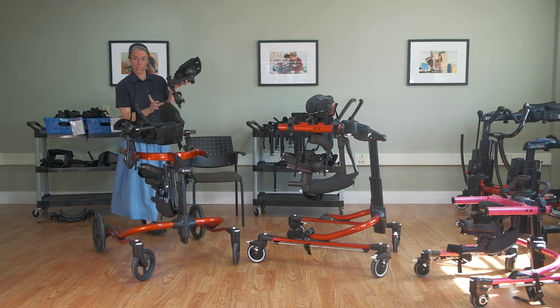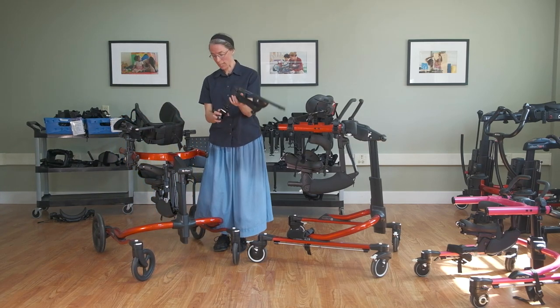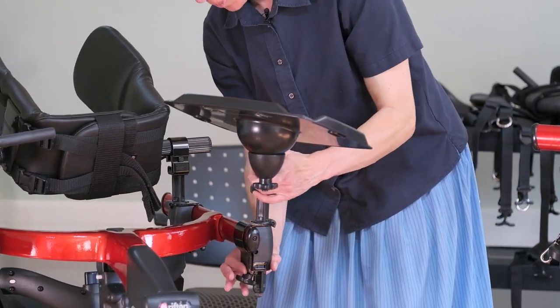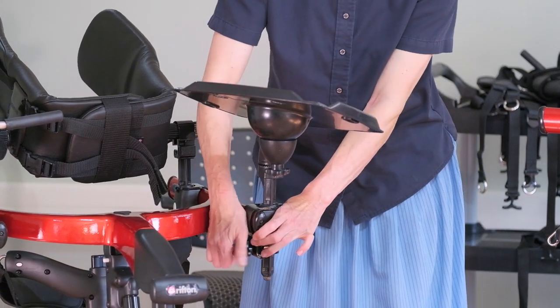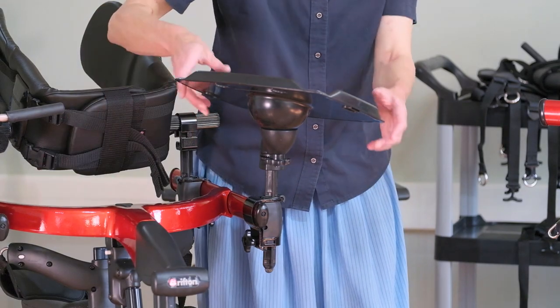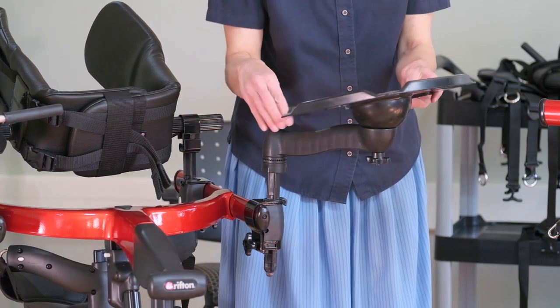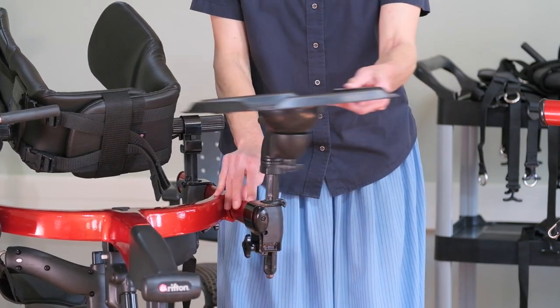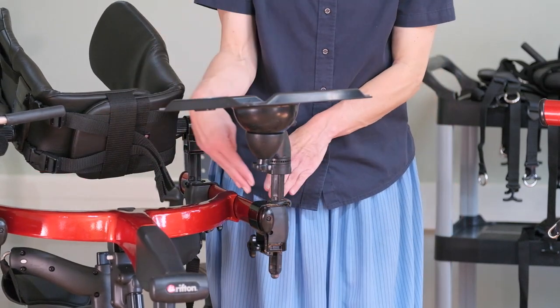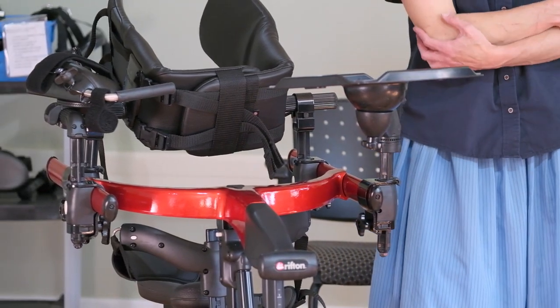One more point: we now offer a communication tray that has two knobs for position adjustment. The communication tray no longer rests on that front bar — it has to be secured at the side — which means we can use these knobs to swing it out of the way or swing it in front. You'll have to make sure it works with the position of the arm prompt if you're using arm prompts as well.